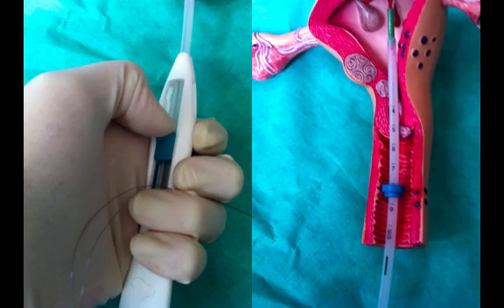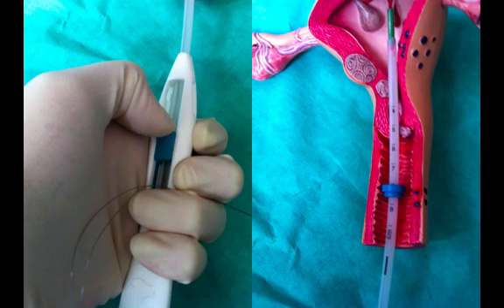Holding the inserter in position, carefully pull the slider all the way down to release the Mirena. Then remove the inserter and cut the threads to leave at least two centimetres visible outside the cervix.